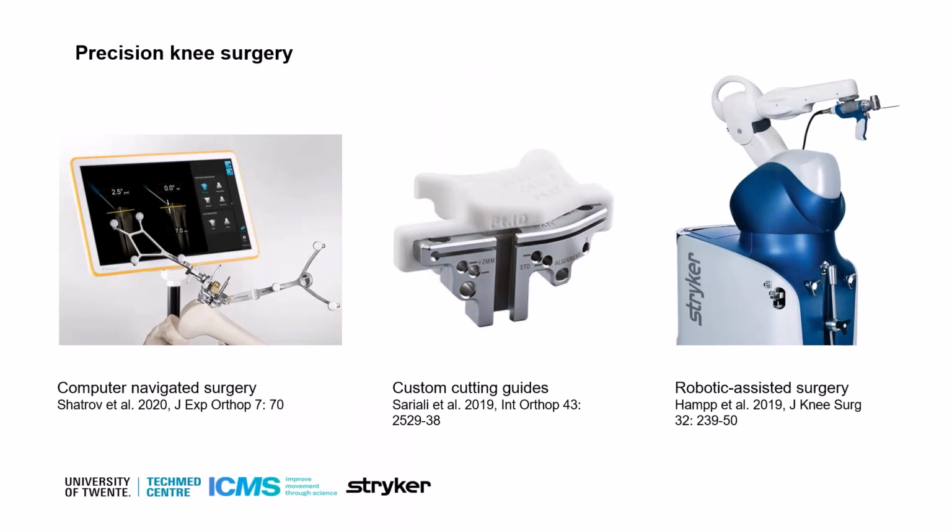Well, technology in total knee arthroplasty has progressed over the years from the manual intervention to knee navigation and the use of personalized surgical instrumentation all the way to robotics and robotic-assisted surgery. And specifically, robotic-assisted total knee arthroplasty has been shown to offer a high degree of accuracy and precision to the plan when compared to manual techniques.